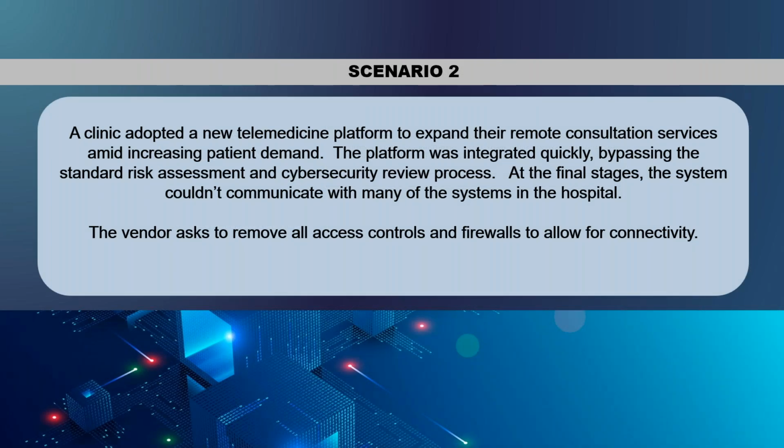And then they also had access to be able to review the ICU vitals. So they actually had to get access into the patient monitoring as well, into that server. Because the cybersecurity risk assessment wasn't done, they effectively didn't have any access control lists whatsoever or firewalls. Because it was implemented very quickly, they wanted to get it working, and then it was blown wide open.